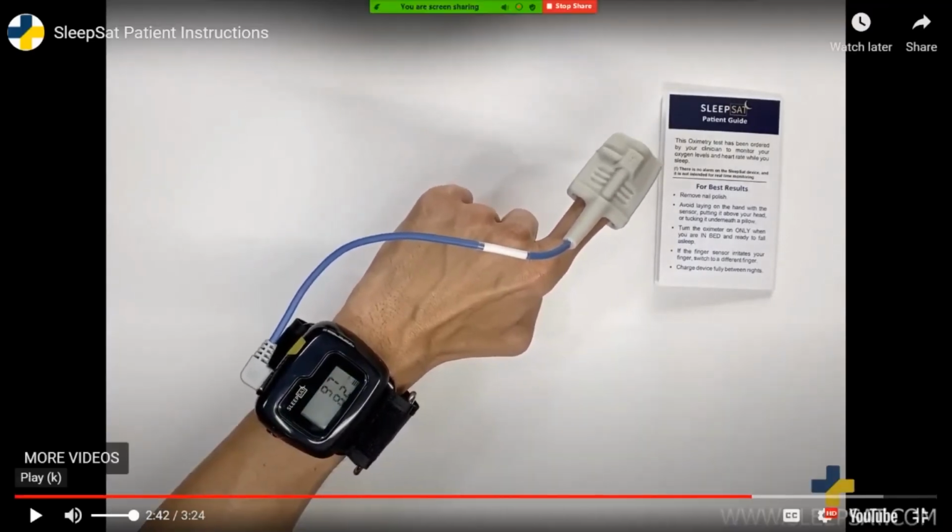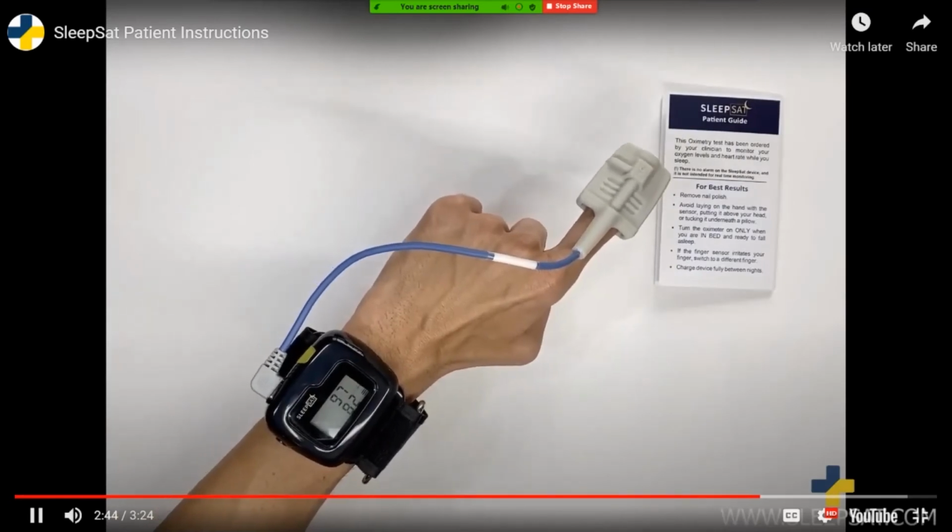Press the power. A better, more concise way to say that is if the patient does not see the little red light coming from the probe, which will be very obvious in a dark room that they're sleeping in, go ahead and just hold down that power button until they see that red light come back on. Power button firmly until the display lights up.